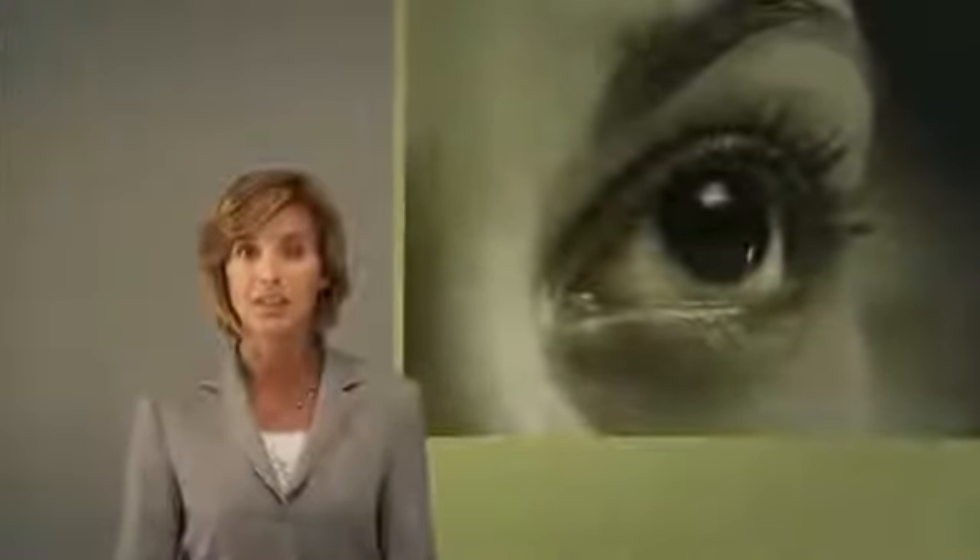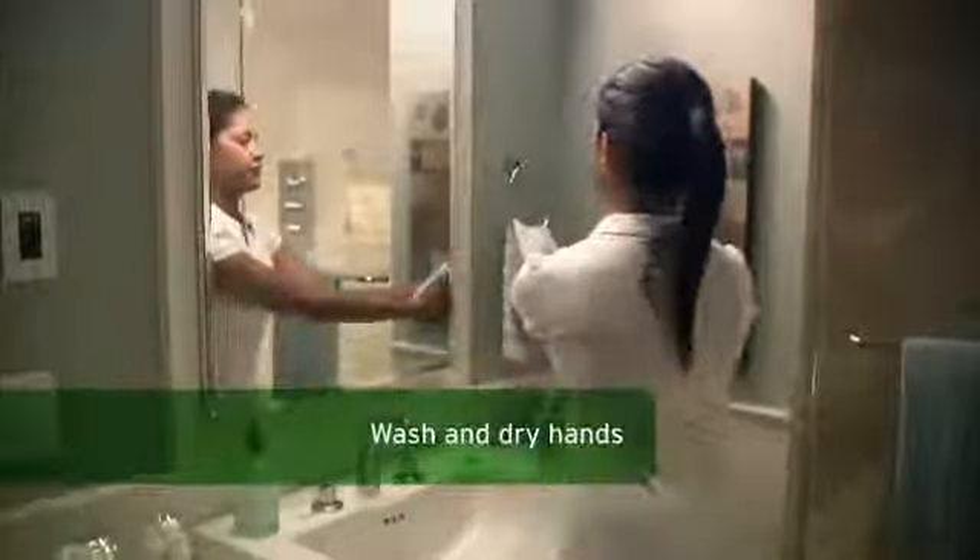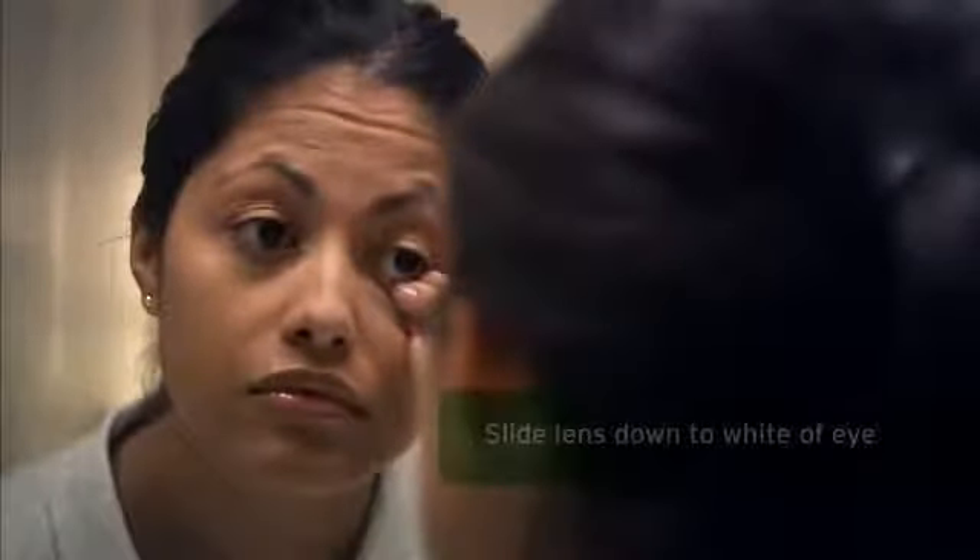Now that we've covered applying your new lenses, let's talk about removing them. Like before, wash your hands with soap and dry them with a lint-free towel. Remember to close the sink drain too. Look up and pull your lower eyelid down with the middle finger of the hand you write with. Next, gently place your index finger on the lower edge of the lens and slide it down to the white part of your eye. Lightly squeeze the lens between the index finger and thumb. Remove the lens gently.